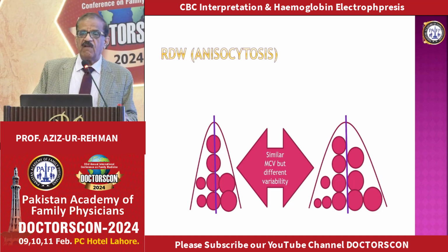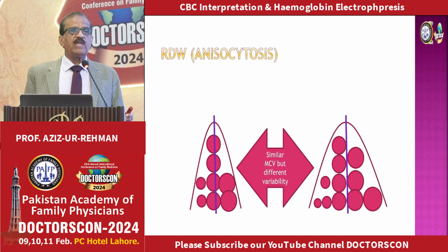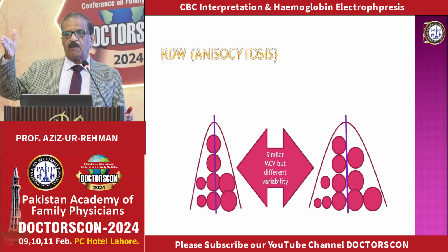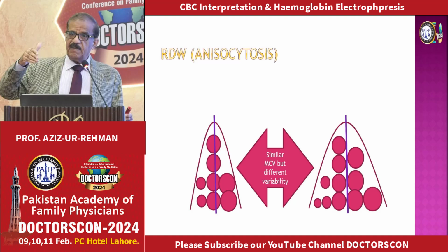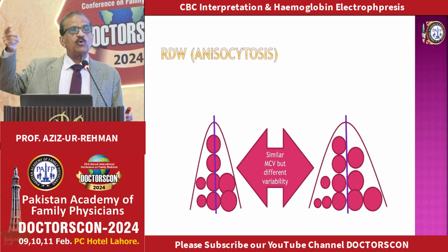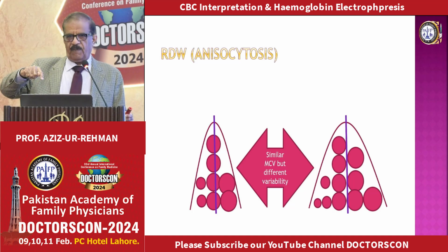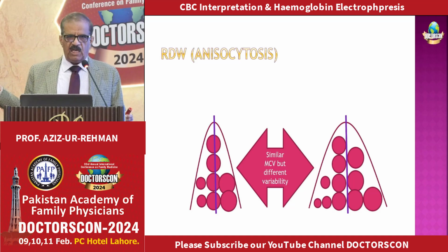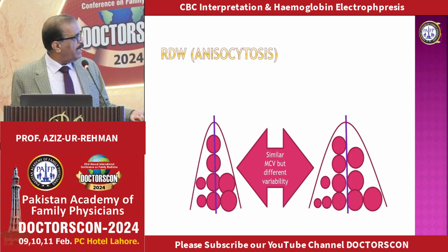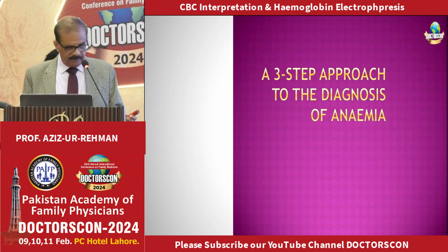Now this is relevant to hypochromic microcytic anemia. Both have a hypochromic microcytic picture, iron deficiency and thalassemia. But in thalassemia, all cells are uniformly small and uniformly contain less hemoglobin. Because whatever mold they are made in, that is the small hemoglobin of that patient. So increased RDW will indicate the presence of iron deficiency.